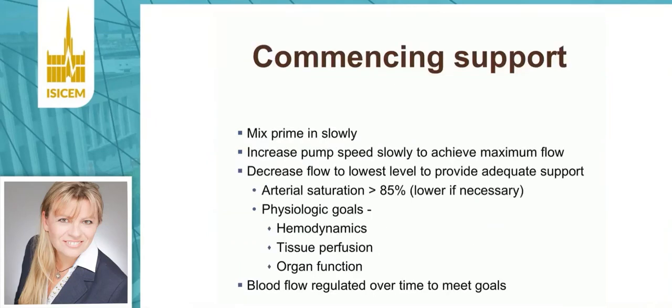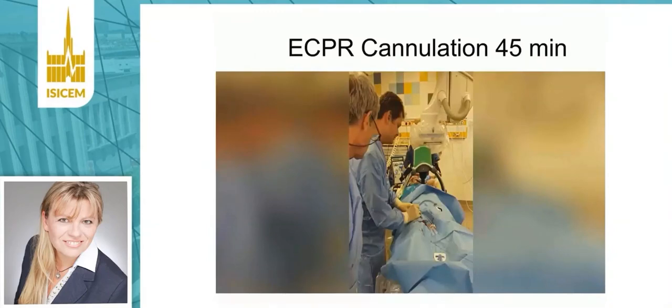Commencing support is to increase the pump speed slowly to achieve maximum flow, and then decrease the flow to the lowest level that provides adequate support. And this is Jan, how he is performing the ECPR cannulation in 45 minutes using fluoroscopy in his cath lab.